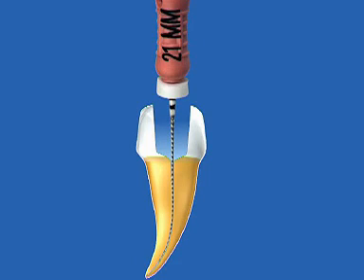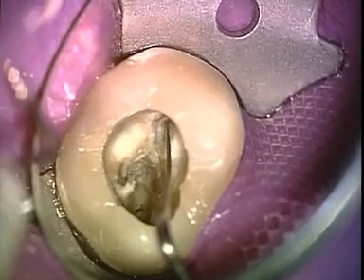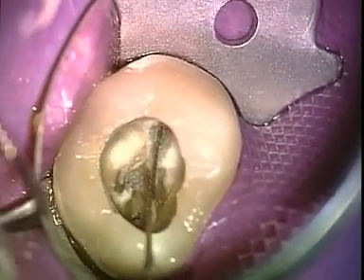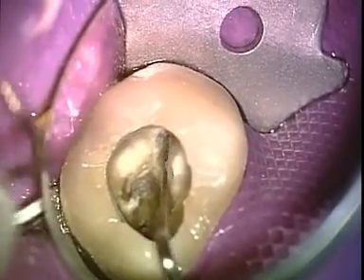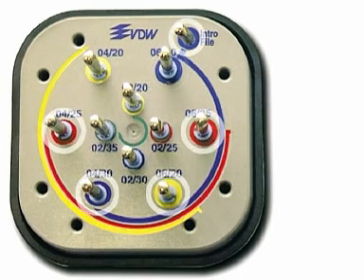The first step is to check the patency of the canals. Pilot files ISO 06 to 15 are ideal for this, or in the molar region as here, MC files with a long handle. If necessary, the openings can be exposed with a round burr. Molars have narrow or medium roots. Consequently, the crown-down preparation starts with the yellow or red instrument sequence.